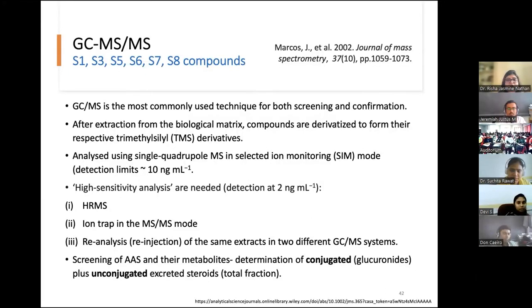inside it. Okay, so the way the dope testing laboratory works, we have a sample that is received in the laboratory, and it is in a good quantity, 50 to 60 ml, or 100 ml, depending on how much the sample has come. Then there's a certain department in the dope testing laboratory where they divide the same sample into different samples. They will put it in different test tubes, okay, and will send it for the screening of each category of drug, okay, to different subdivisions.